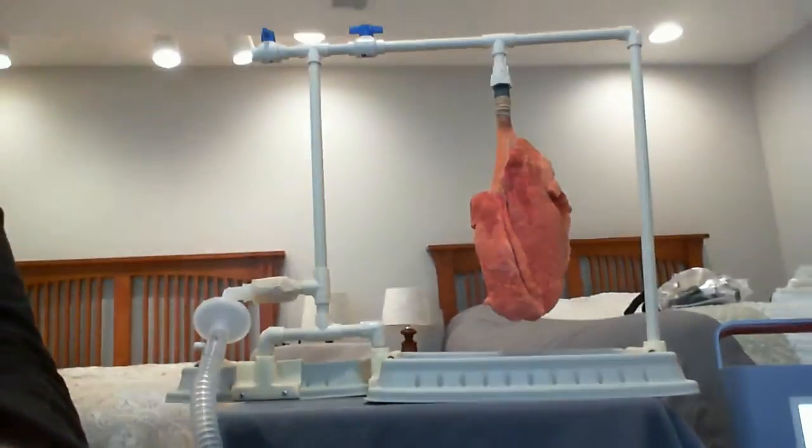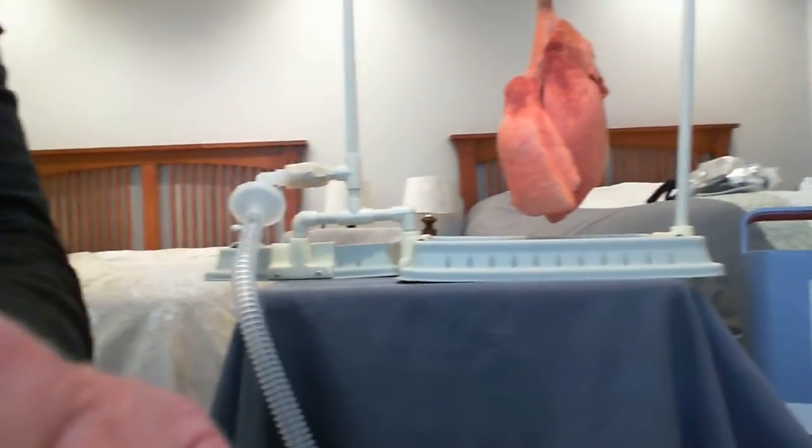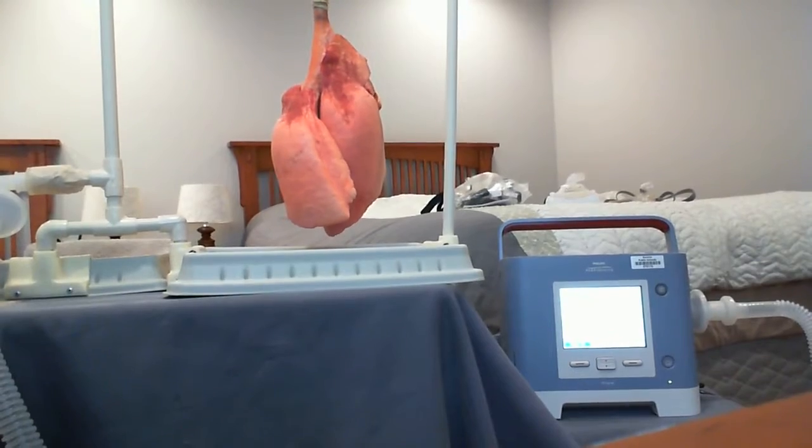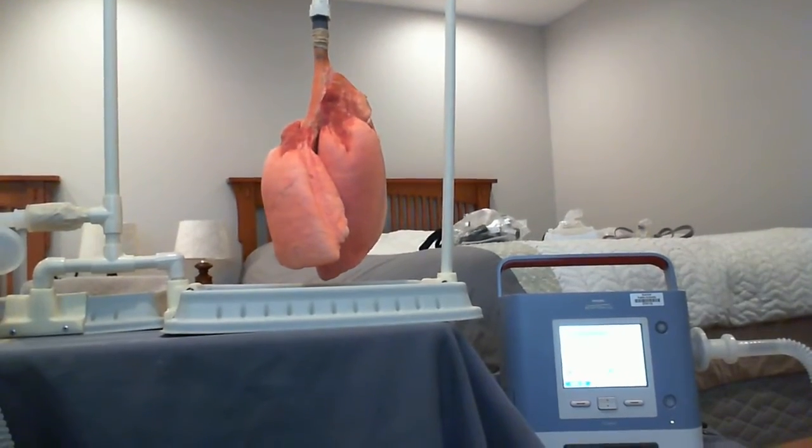Notice how our lungs are going to start inflating. Okay, so they were absolutely de-recruited, and now they're going to start recruiting. Okay, so they're going to start inflating.